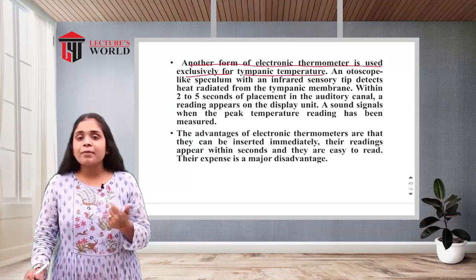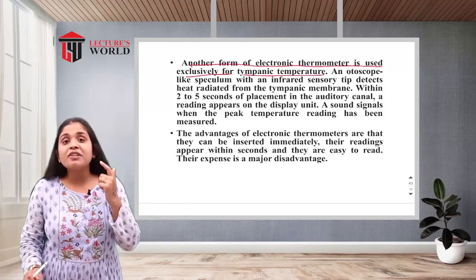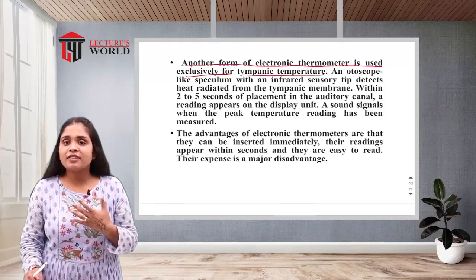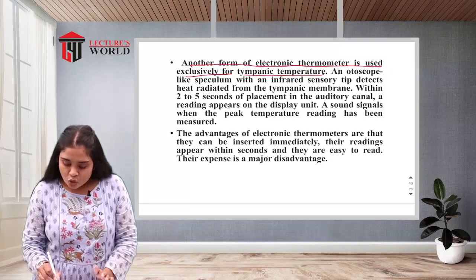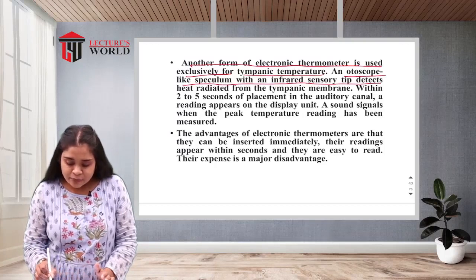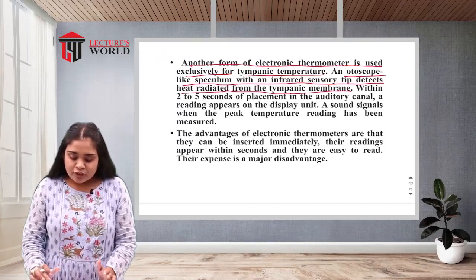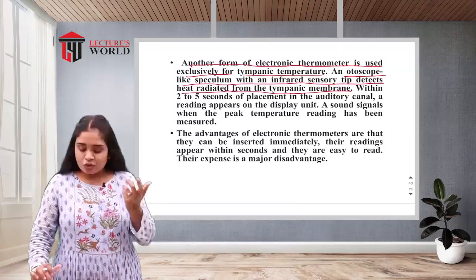So tympanic temperature, it will be like we are checking the temperature from the ear pinna. From the ear side we are taking the temperature. So an otoscope-like speculum with an infrared sensory tip detects the heat radiated from the tympanic membrane. So here what will be there, like the otoscope.